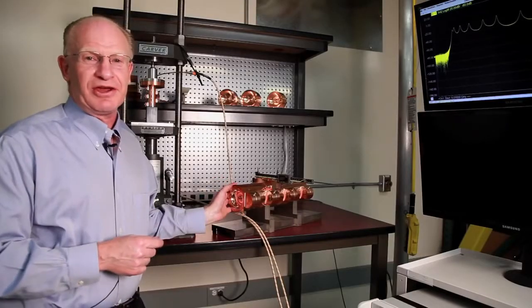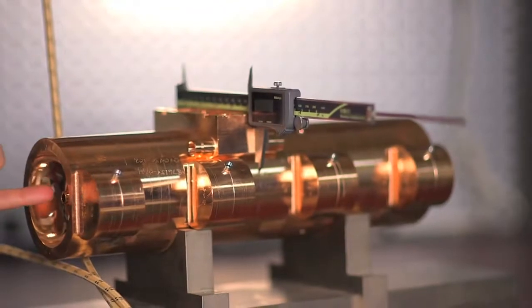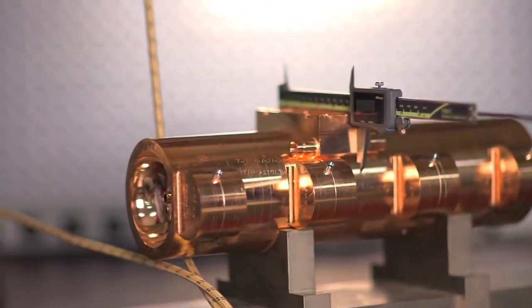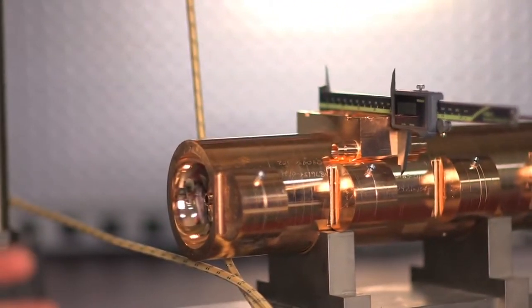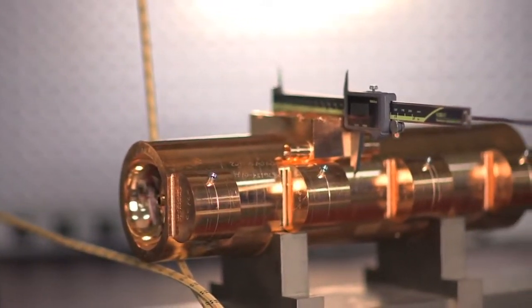So this device right here is the heart of a linear accelerator. Electrons are injected at one end and at the other end they can achieve the speed of light before hitting a tungsten target. And this basic concept was created at Stanford.